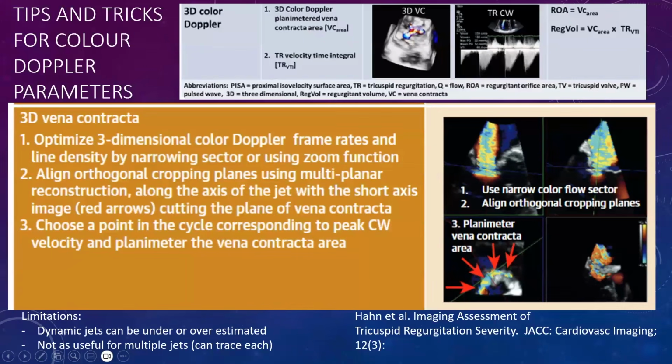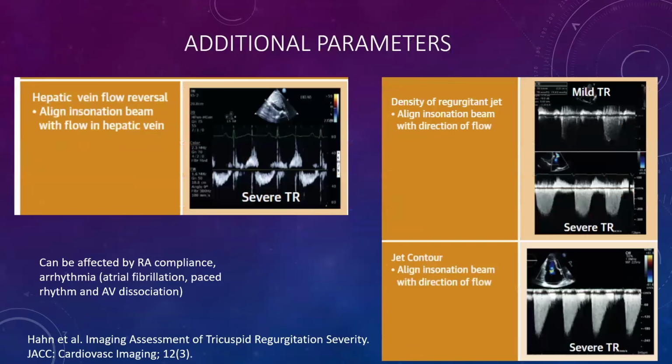Again, not as useful if you have multiple jets because it can be time consuming, since you have to add each separate jet.